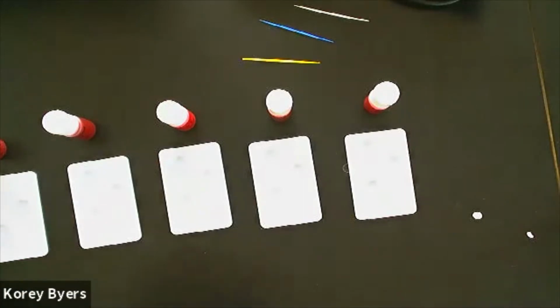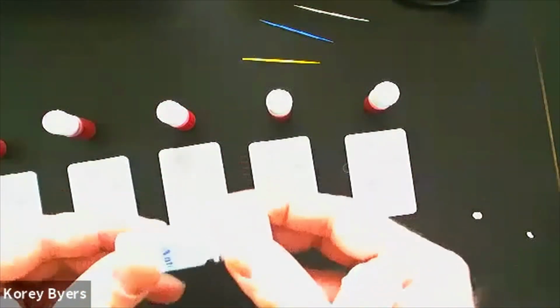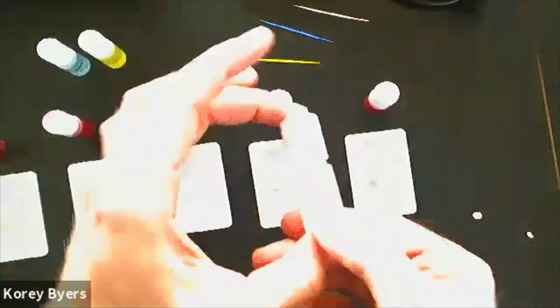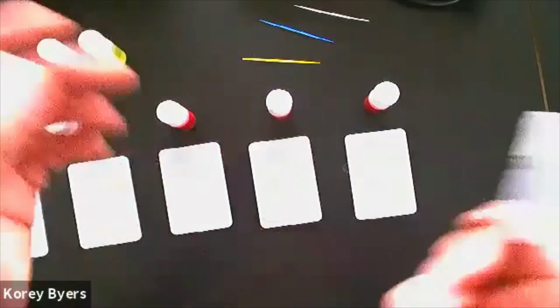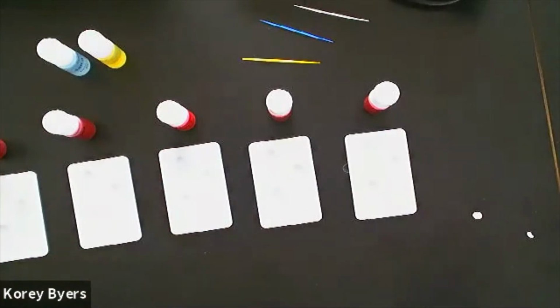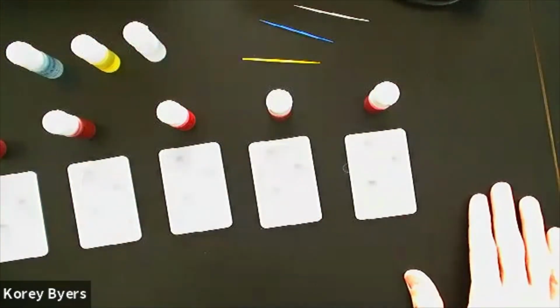You'll also have 3 different antibodies or antiserums. Antibody A, ignore if yours has mildew. I don't know why they're growing mildew and mold. Antibody A, antibody B, a yellow one, and anti-D, a clear one. That's the RH factor. Remember we just used D for RH. I'll look up why one day. I've not looked it up yet. I think it's because we have actually 20 to 30 different blood types, and RH is just one of them. But anyway. We have a mystery. We're pretending that we're working in a clinic.